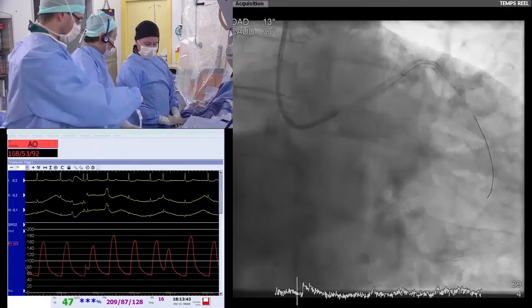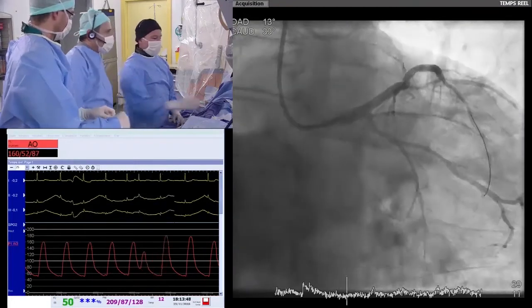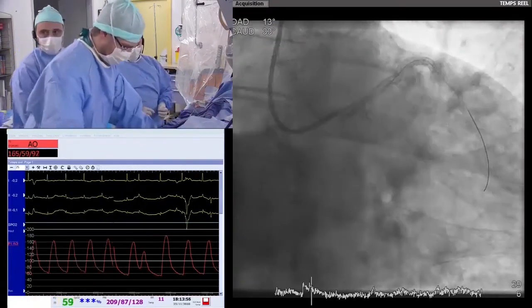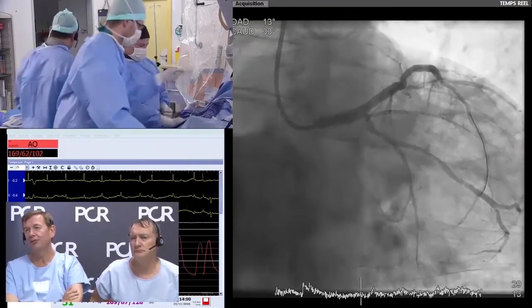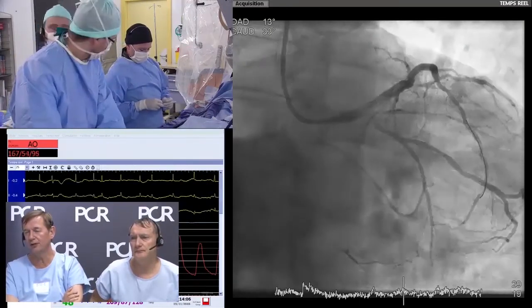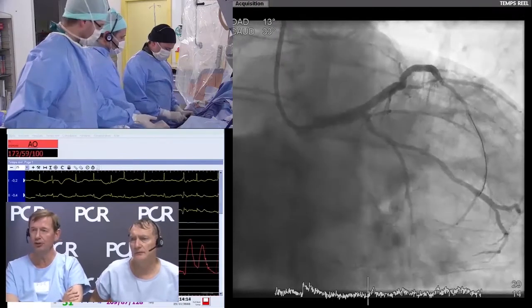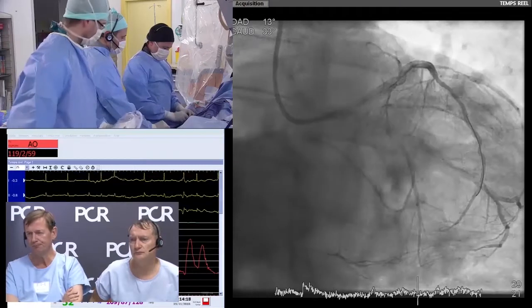Perhaps what could be useful is just to do a run with IVUS. We assess the stent. Yes. We will do an IVUS and we will decide. How do you feel about the result, and what do you think we should do? Well, it's an astonishing result. You should be very proud of an incredible demonstration of how to look after severely diseased, diffusely calcific disease of both the LAD and the left main. I think the IVUS would be interesting and educational, although I appreciate it may not be something you would normally do after going up with a 5mm balloon.